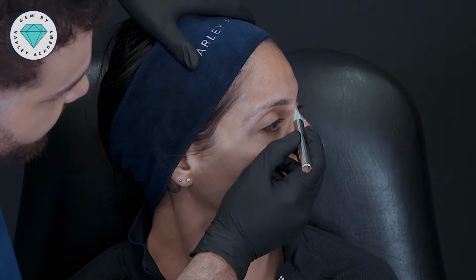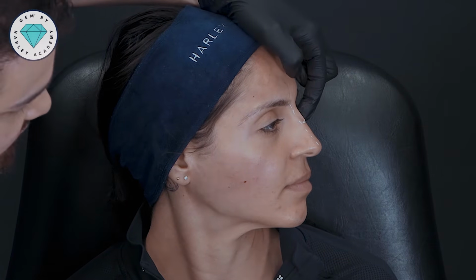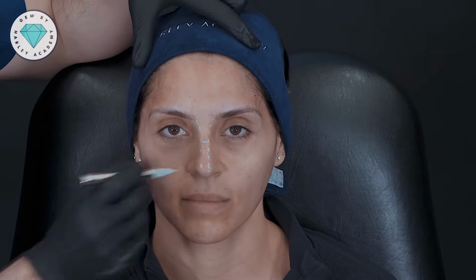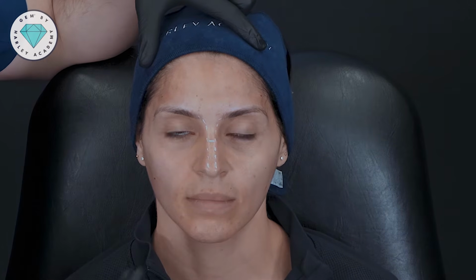We have a little bit of a dip before the hump, and so this will allow me to straighten the nose. If I just create some projection above the dorsal hump, that's going to create a really beautiful straight aesthetic nose. On the frontal view, there's just a little bit of irregularity as we move down those aesthetic lines, and so trying to smooth that out and create a really nice light reflex across the midline will give this nose those aesthetic highlights, which I think would be very, very nice.